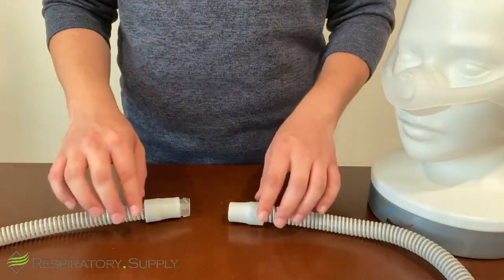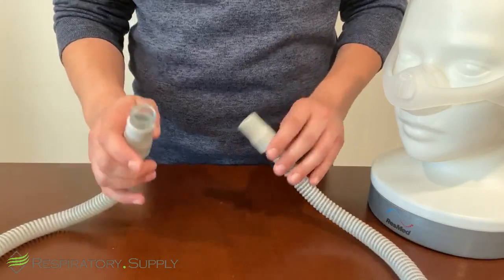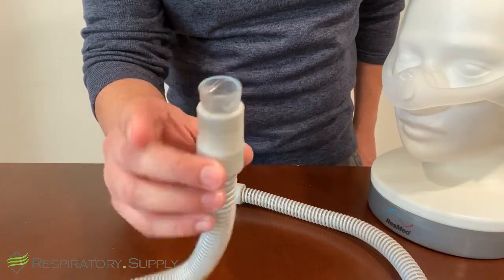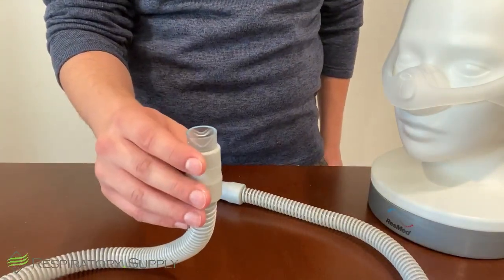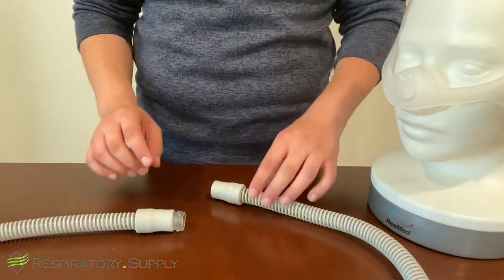To start, I think it's best if we take a look at an example to show you what a connector looks like in the tube and what a tube without a connector looks like as well. So first we'll start with the Vitara connector. Still lodged into the end of the rubber here. As you can see, it extends past the rubber itself. Not really any give when you try to squeeze it. The plastic is firmly in there to prevent any air leaks when using it during therapy, which is a great thing, but at the same time makes it hard to remove. So I'm going to show you how to remove that one in just a moment.